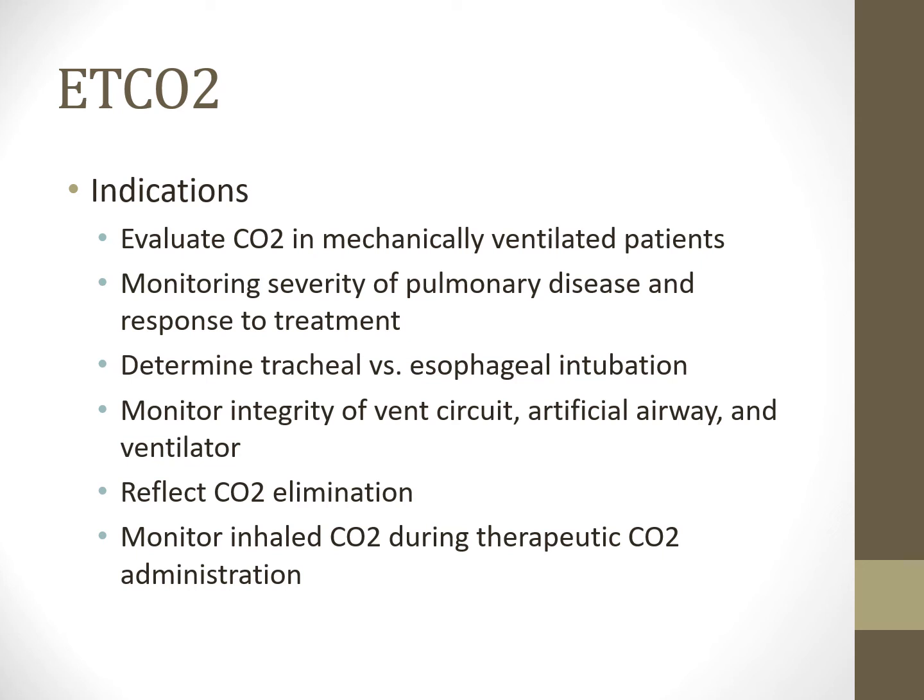Monitoring severe pulmonary disease in response to treatment. Of course, we can see how well they're responding to our therapeutic interventions. As far as intubation goes, we can see if it's esophageal versus tracheal. I love waveform capnography for intubation because then we know right away that they're in or not. We don't have to wait for some other issues to show up. Monitor the integrity of the vent circuit, artificial airway and the ventilator. We can actually see if the patient's extubated or intubated. It's pretty straightforward.